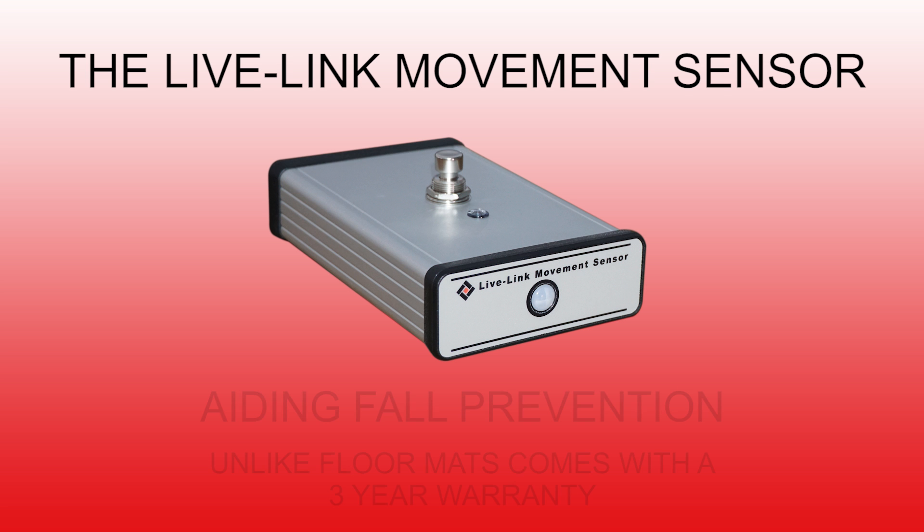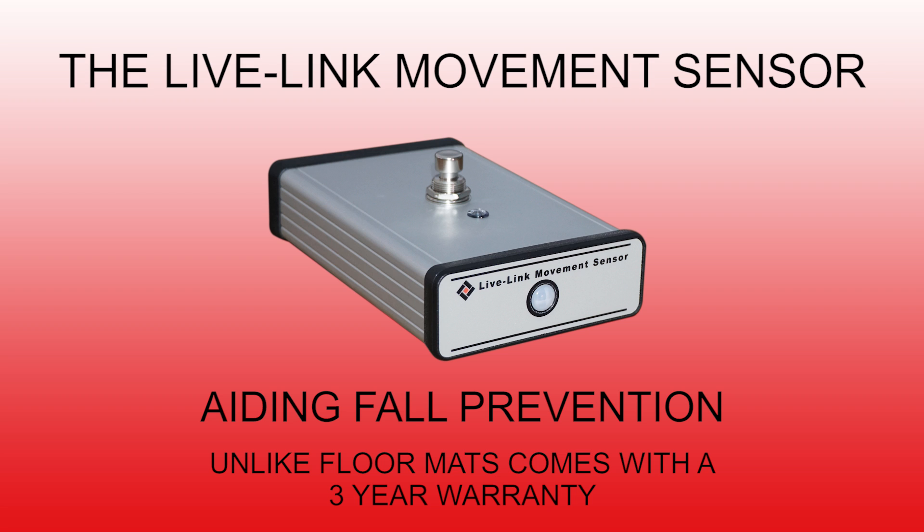The LiveLink movement sensor has been designed as a fall prevention aid in care homes. It can also be used in hospitals as well. You've got residents now that are getting older and frailer, and you need a piece of equipment to monitor them.